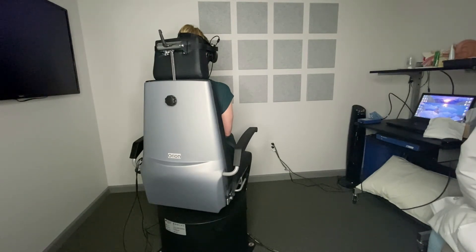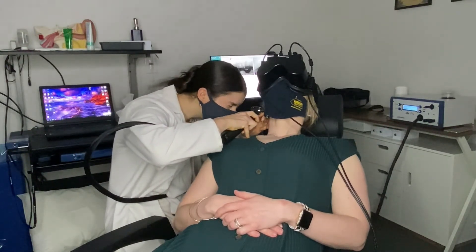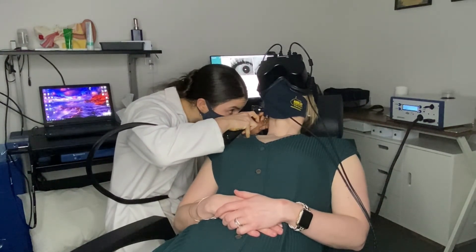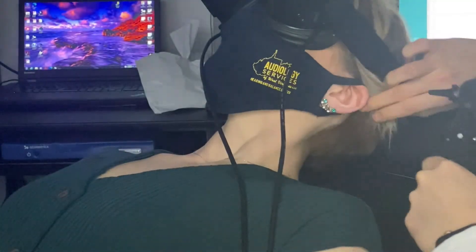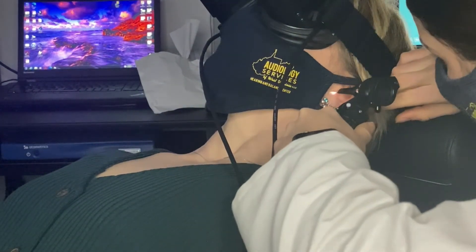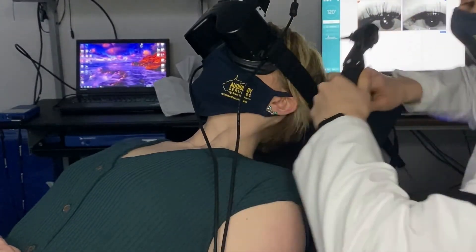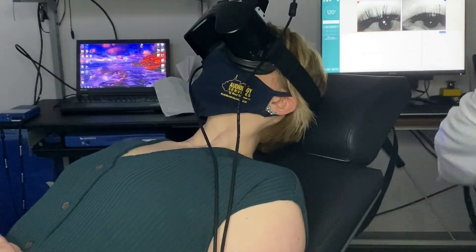The last test we'll do is called caloric irrigations, where we use air or water to artificially tell the brain that you are turning around in a circle, even when you're not. This gives us a really good look at how the right compares to the left and if there are any weaknesses that we need to look into.